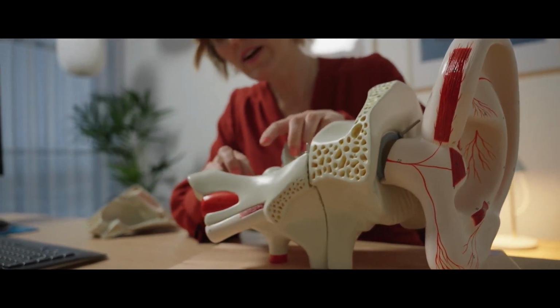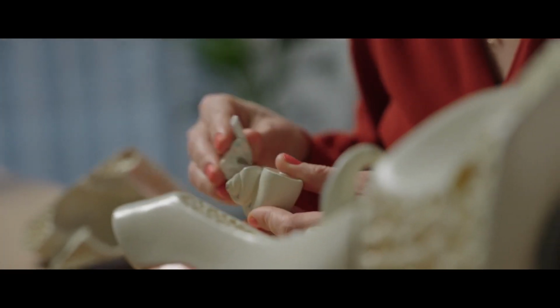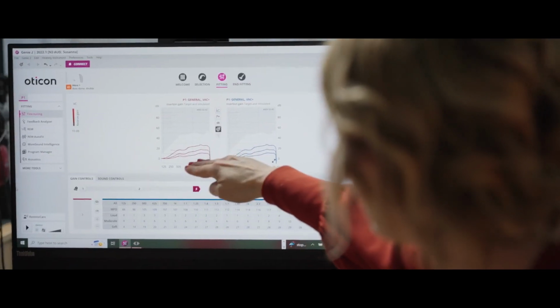So how do you go about this? How do you see this? Well, what we're presenting here is new territory for our hearing care professionals, and I think, frankly, for the field of audiology, because you're now able to take this single ACT value, one ACT value per person, and use that to prescribe the right amount of help. We haven't had that before. We've used speech and noise tests more for validation purposes and for counseling, and those are also very good pursuits. But I think having something to help you up front, set the baseline correctly before you send your patient out the door, that's the valuable part where ACT can do something new.